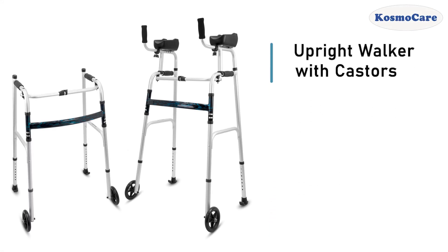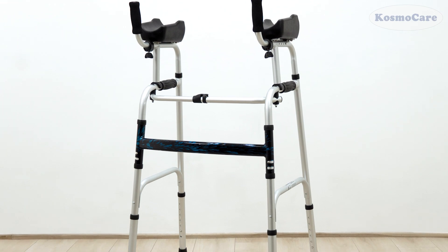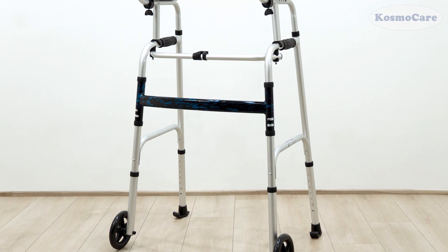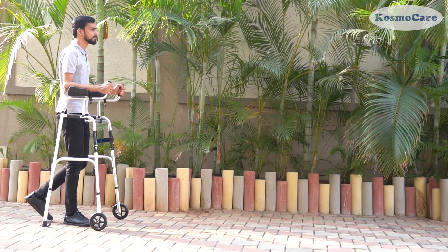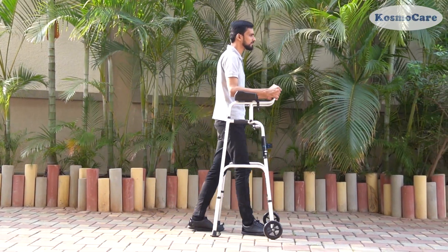Introducing the CosmoCare Upright Walker, distinguished by its innovative design featuring forearm support, eliminating the need for users to lean forward. Crafted with a robust anodized aluminum frame, this Walker offers a reliable helping hand and aids in accommodating a more active lifestyle.